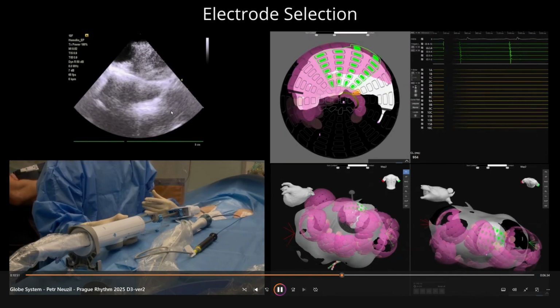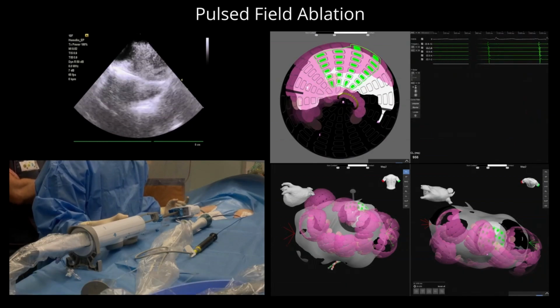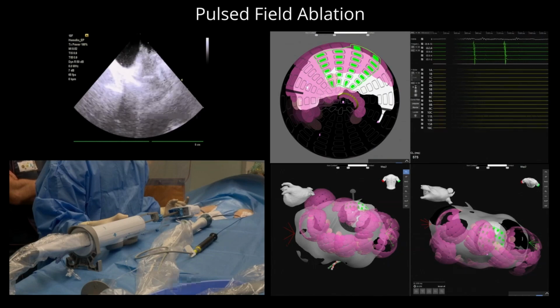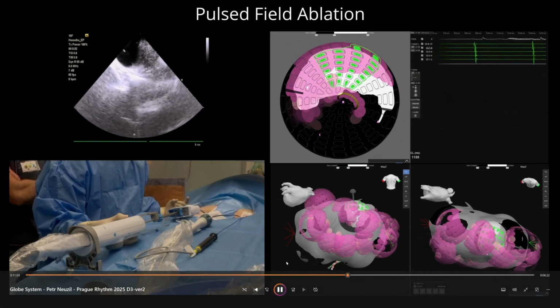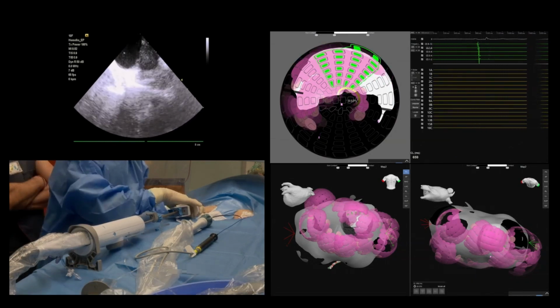But don't complain about the anatomy shape, because you really deviate the borders. It's not representative anatomy when you push, but you need to push to get the contact. You need to be balanced.